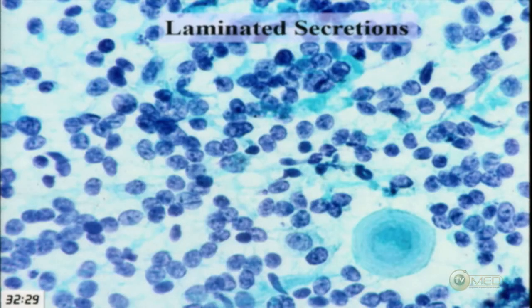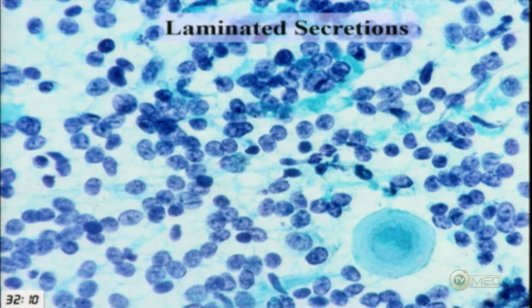At higher power, we see cells with abundant pale cytoplasm and secreted material. At first you might think it resembles the matrix of adenoid cystic carcinoma, but it's different — it's concentrically laminated, almost like a psammomatous calcification but more proteinaceous. So the secretion is different from matrix-producing tumors.